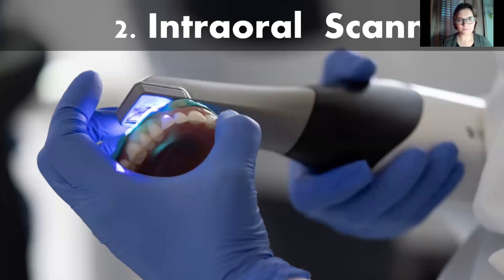The one thing that I have found, and that I've seen consistent with companies, is that it actually works better in most scanners if you start by scanning the impression first and then rolling around and scanning the denture teeth, which is kind of counterintuitive. When I first started working with scanning dentures back in the early 2010s, I would scan the occlusal table and then roll into the impression, and it doesn't seem to stitch as well. As we've started to develop protocols with the different intraoral scanners, we found that it's actually better if you scan the impression first and then roll around onto the occlusal table.